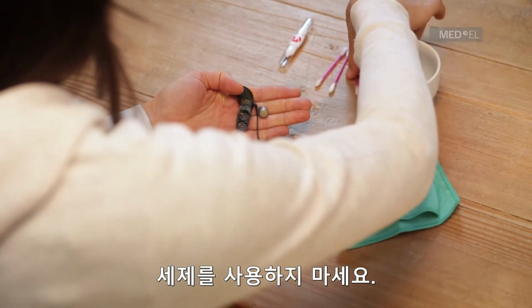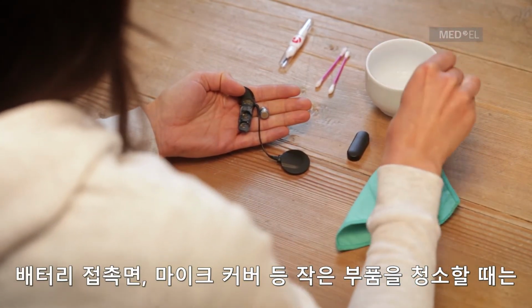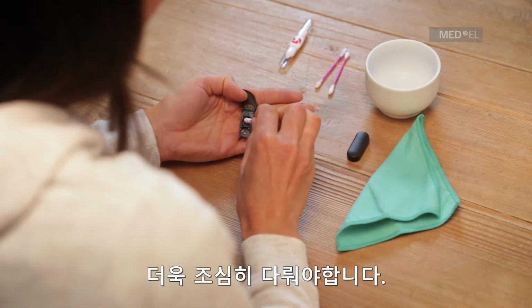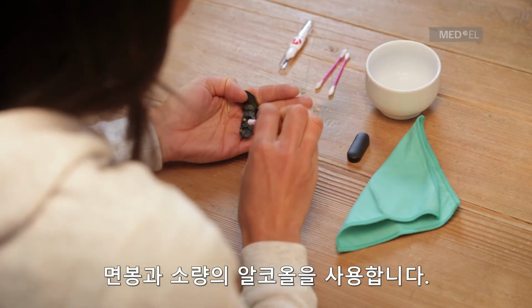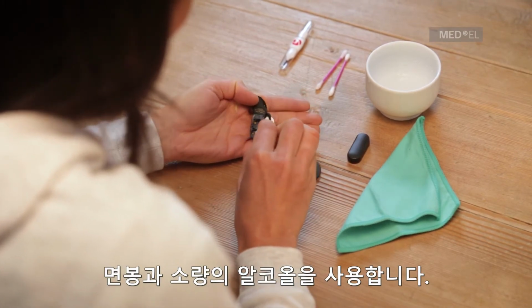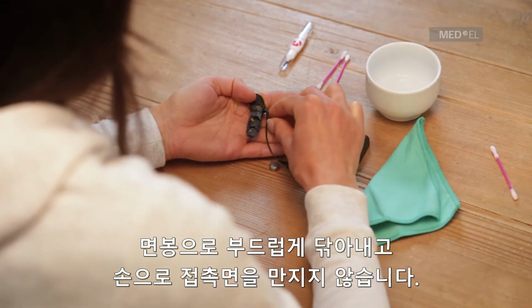Don't use cleaning solutions. Use extra care when you clean any small parts, such as the battery contacts and microphone covers. To clean the battery contacts, use a cotton swab and a small amount of rubbing alcohol. Gently wipe them dry and avoid touching the battery contacts with your hand.